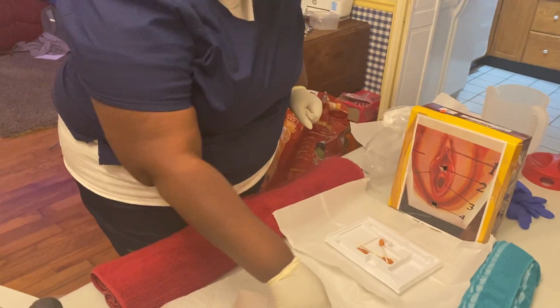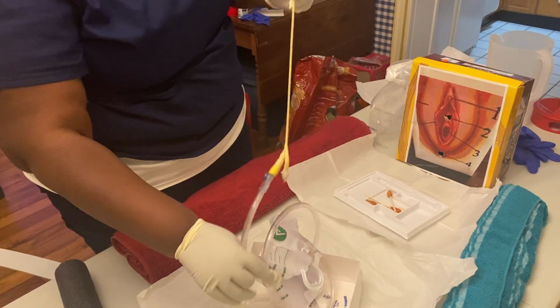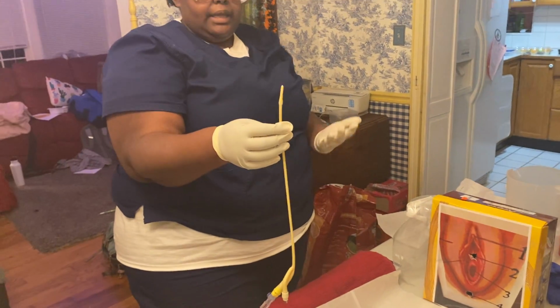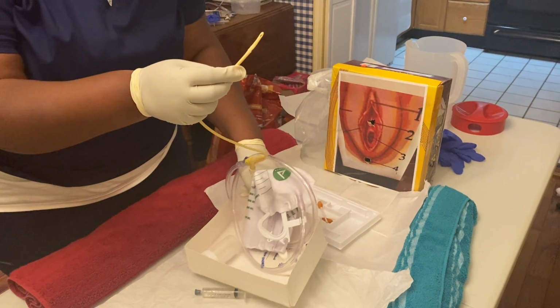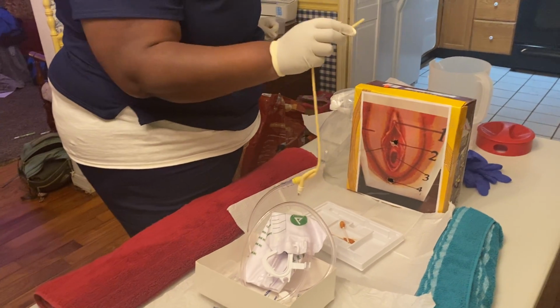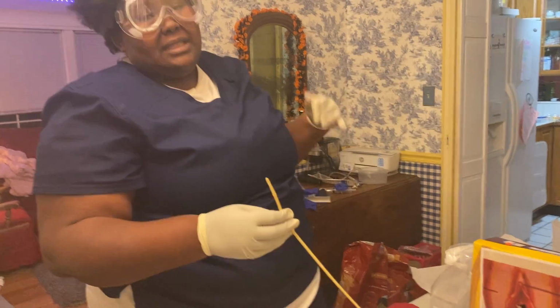Then I will grab my catheter. Usually there will be a plastic cover on this, but I use it so much, there's not a plastic cover on it. And then I'll also move the box closer. I will dip it in my lube. For females, it will be 1 to 2 inches, and for males, it will be 5 to 7 inches.